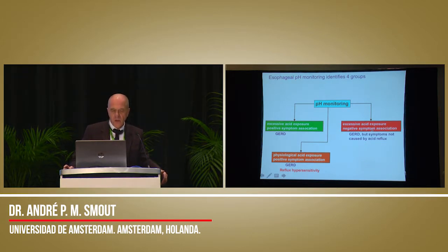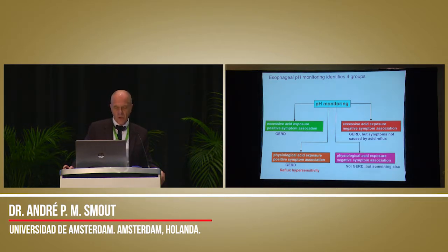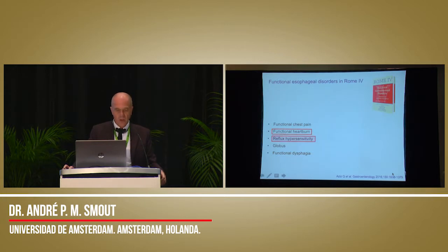Then you have patients who have excessive acid exposure, but a negative or not positive symptom association. You may argue that they have GERD, but it seems that their symptoms are not caused by the acid reflux. If they have esophagitis, you can call them GERD, but if they don't have esophagitis, you probably shouldn't call them GERD. And then there are patients who have physiological acid exposure and a negative symptom association, and these are usually labeled functional heartburn, as you all know.